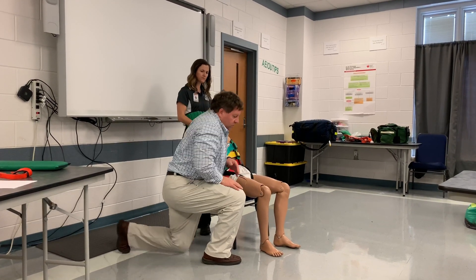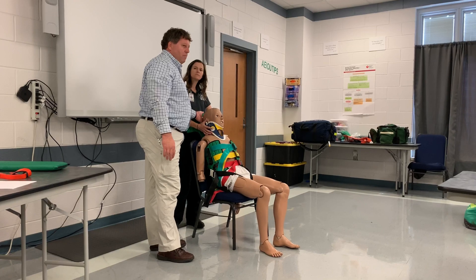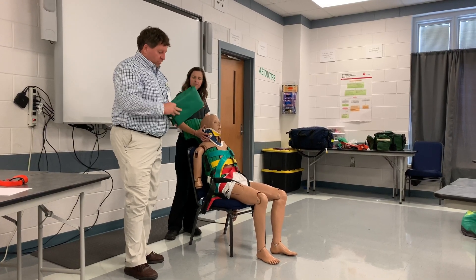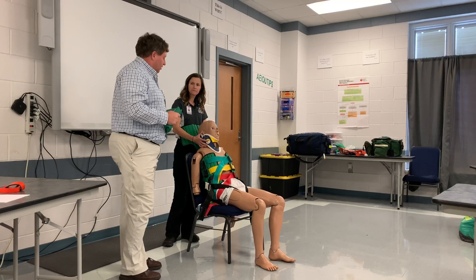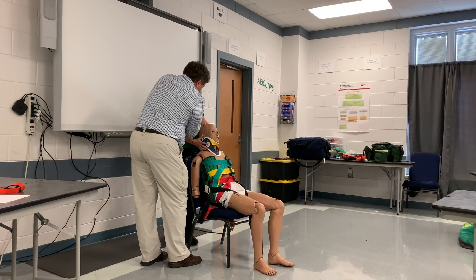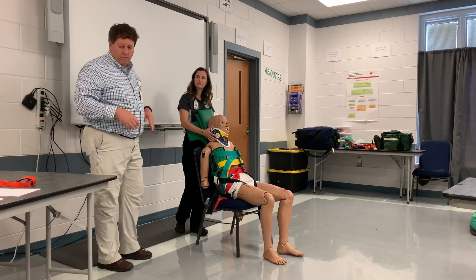I don't have the head stabilized yet, so I have to do that. For most people there is a gap between the head and the device, and how big that gap is you'll have to fill - and that's what this pillow is. For most people you'll end up folding it into thirds or you fold it in half. I usually squeeze the air out of it and get it pretty flat, then slide it back there and it's got a pretty good fit. It might not even be able to get it folded. It's not fully stable up against the device yet.